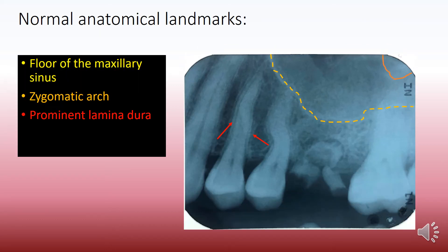The normal anatomical landmarks seen in this region are the floor of the maxillary sinus, the zygomatic arch which is shown by the orange line here, and of course prominent lamina dura seen in the first premolar.